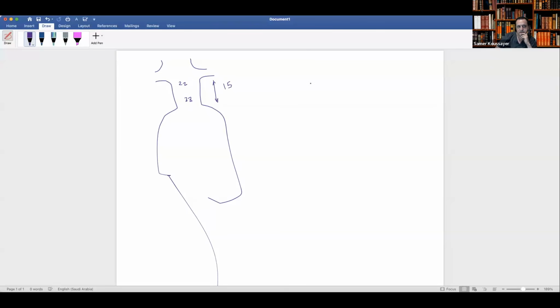If you use a 26 graft, when you put 26 here, in this area you're oversizing 15 or 20%. Oversize here 20%, here 20%, here 20%. So you're always oversizing 20% because it's the same diameter over the length of 15. Okay? So this is called the neck.